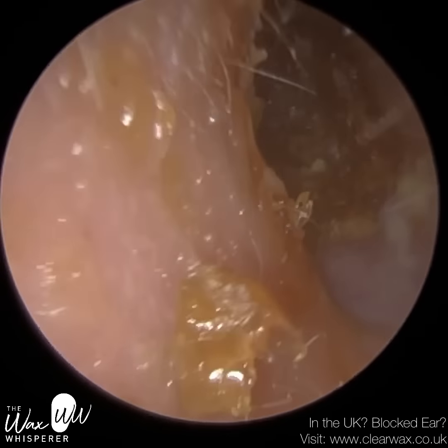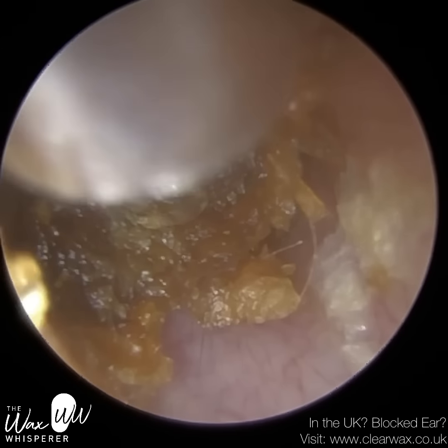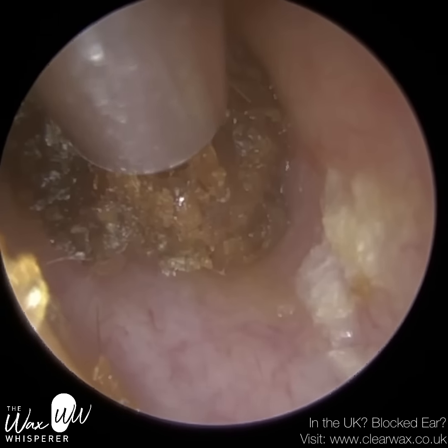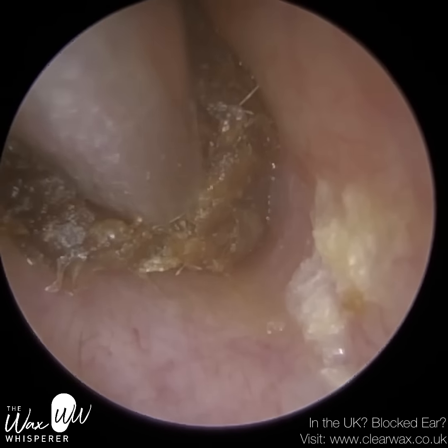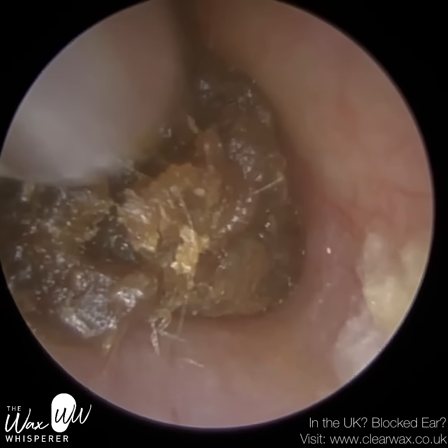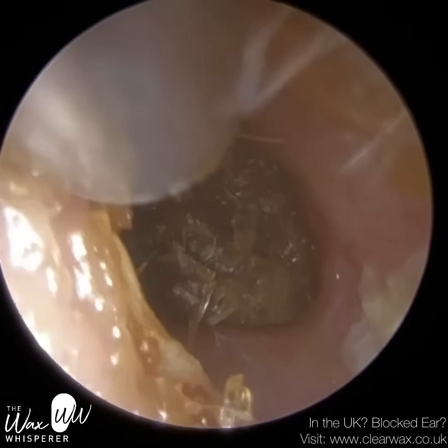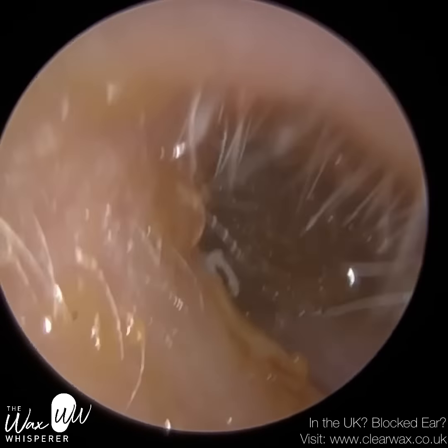However, the patient still had quite a lot of residual wax and skin deep in the ear, and this is a bit softer. So I resorted back to performing microsuction. It's right up against the ear, so you wouldn't really want to use a hook this deep because you'd come into contact with the bony part of the ear canal, and also potentially the eardrum, which would be very sensitive and uncomfortable. It's just trapped in the inferior recess.